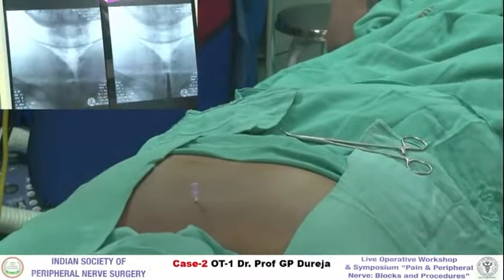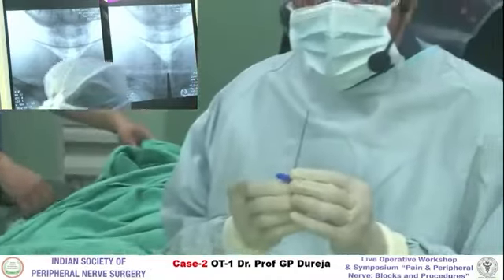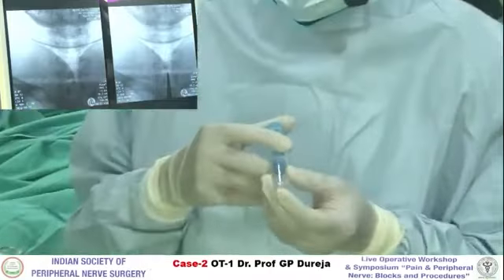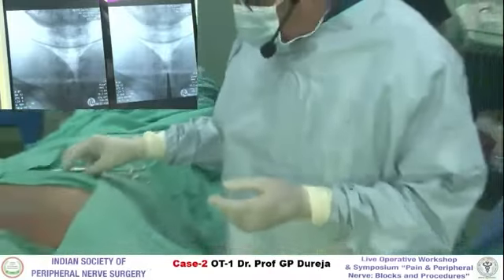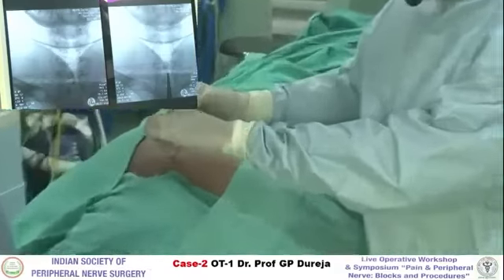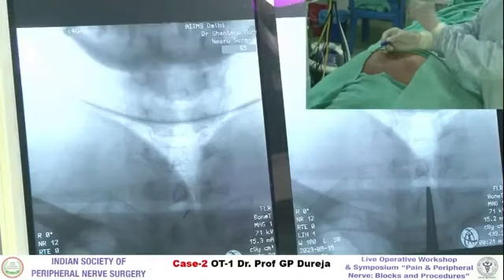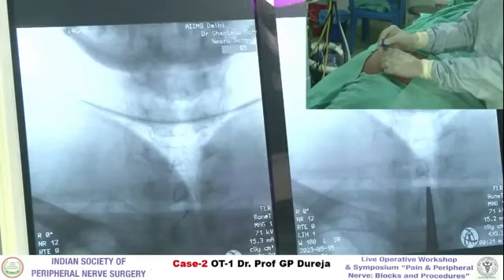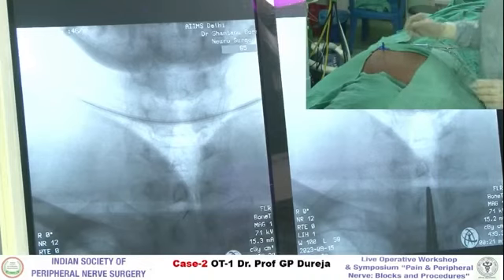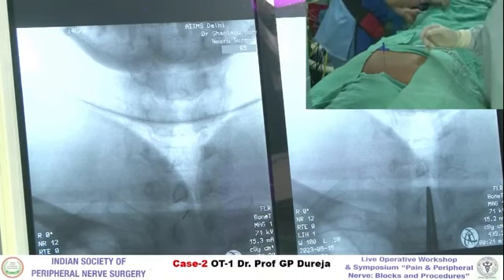The two things which we require are an epidural needle, 18 gauge, and a special loss of resistance syringe. We have already given local anesthetic. Any sedation given, please? This local anesthesia is given in the skin, subcutaneous tissue, and the interspinous area. Okay, sir. Please shoot.